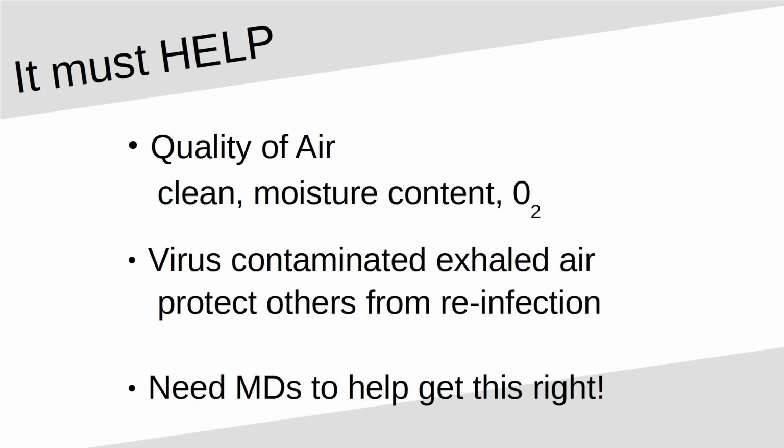It is very important that you're not exposing the patient to incredibly dry air all the time, so there's got to be some way of making sure that the air presented to the patient is not only clean, but has sufficient moisture and probably has a measured amount of oxygen in it.